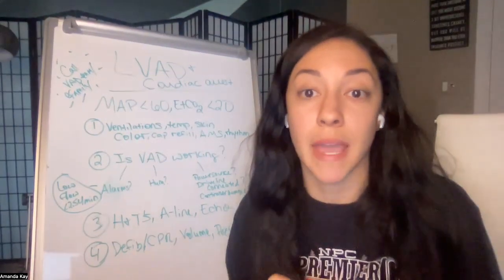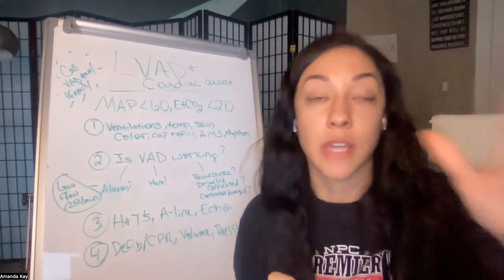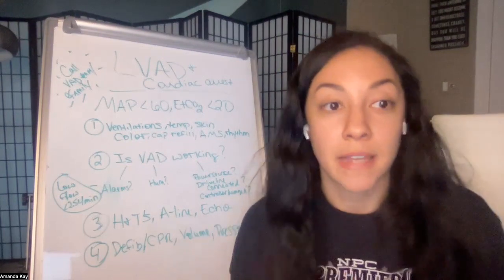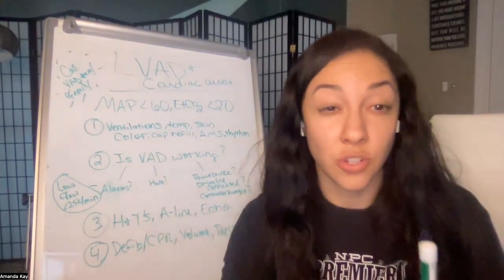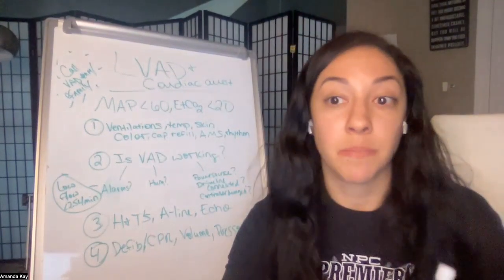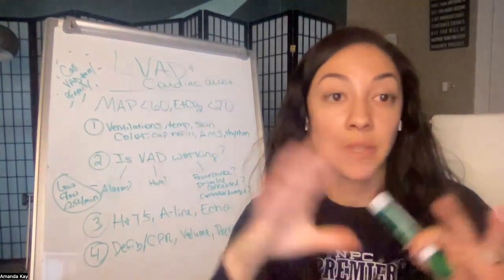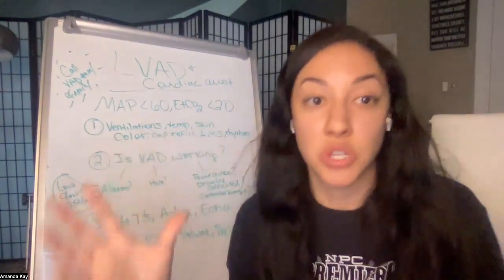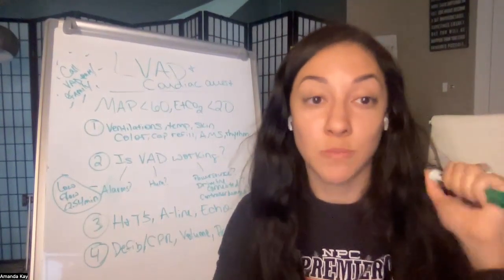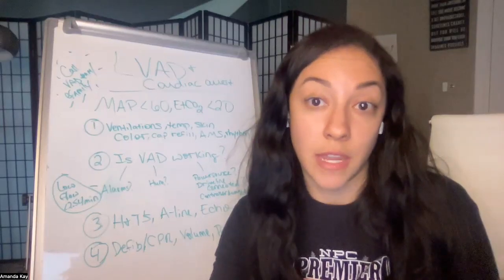And another thing to keep in mind, these patients do have some native residual heart function. Some do, I don't say all of them. Some of them will have native heart function that might circulate blood for a little bit should the LVAD stop. But some people are completely dependent on the LVAD, and their AV valve is completely oversewn. Like they couldn't even use their heart if they wanted to. They're completely dependent on it. So just keep that in mind. Sometimes you might be able to see a little bit of native heart function come through. Some of them might not have any, okay?